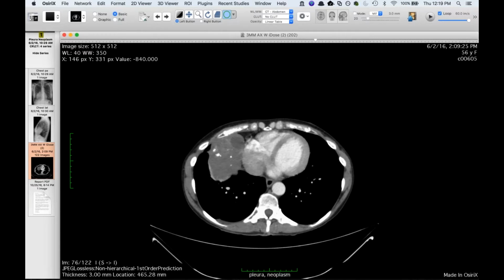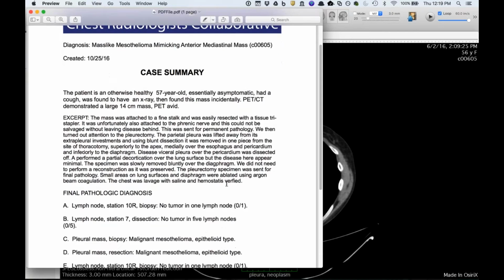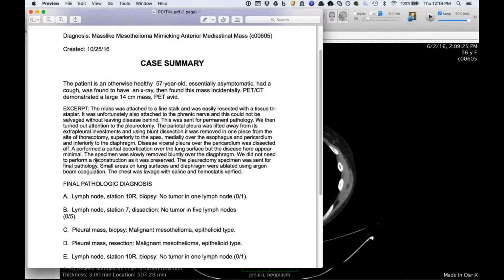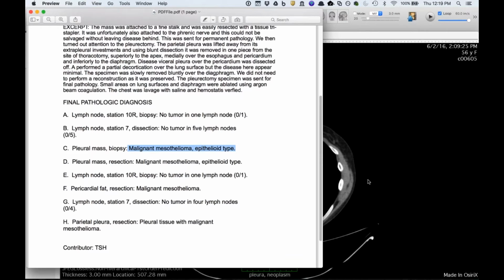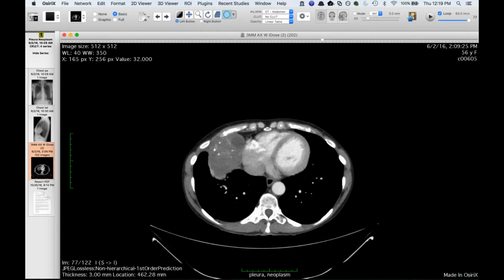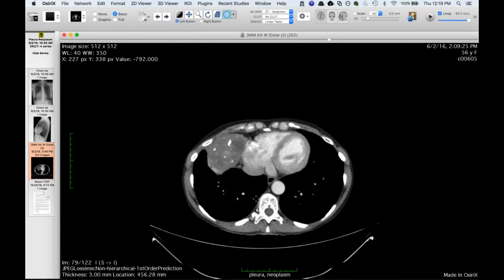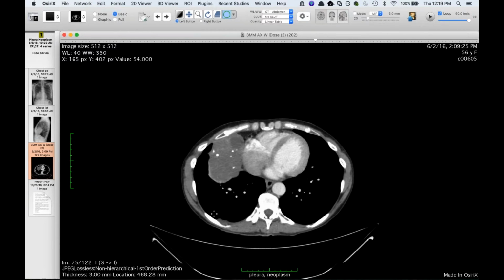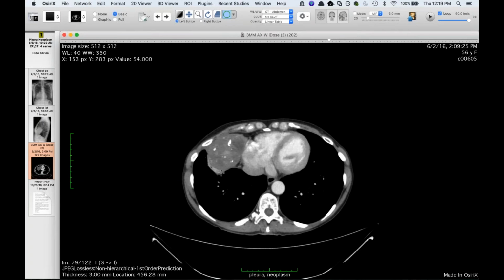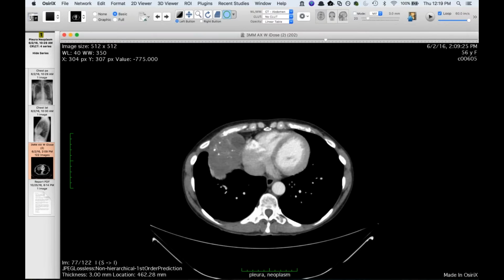Well, does it have anything in the abdomen creeping up? Nope. They took it out, and it was a mesothelioma, epithelioid type. Ah, so I know we've shown a couple of more mass-like mesotheliomas, but this is another one. That would not have been in the top 5 of my differential, but that's what it turned out to be. There was some involvement of the pleura posteriorly too. So it's just another fooler. Obviously we've seen the rare mesothelioma that gives you a more mass-like appearance, and this is another one of those.